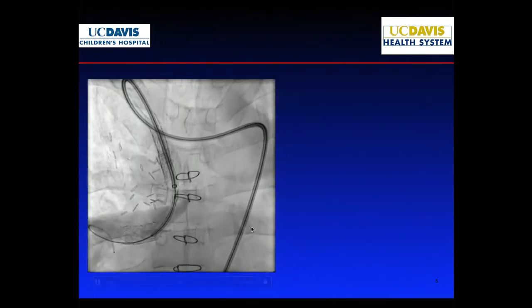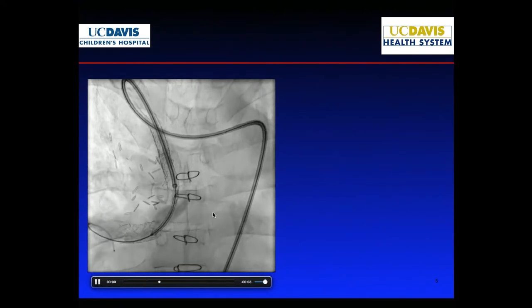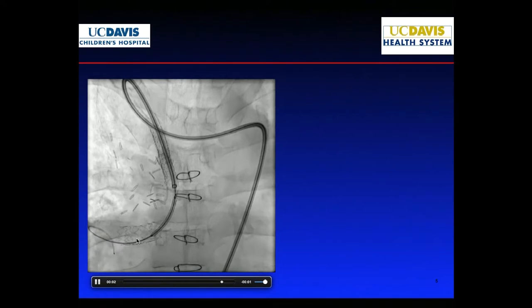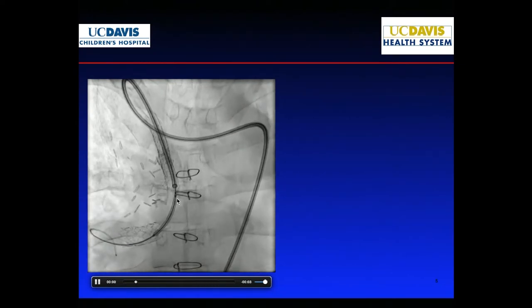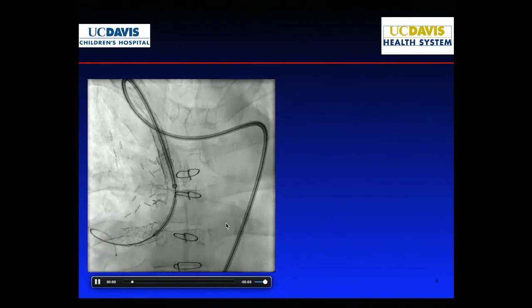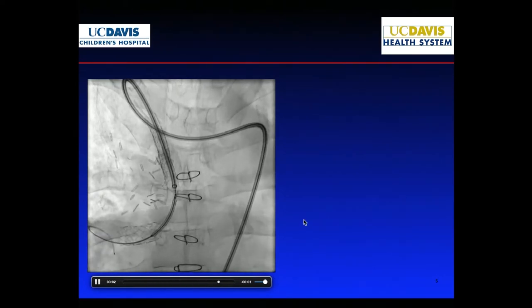It's not there. So we were able to put a second stent in, and this time the plan was to telescope into the first stent. You notice how big this vessel is, almost 18 millimeters, and we had a 10 millimeter. That was done on purpose because I was worried that an 18 would not fit this area. So knowing that the diameter of this stent was going to be smaller here, the plan was to let it anchor in the stenotic region. Remember, we're still going through a BT shunt, so you can't put a huge sheath there.